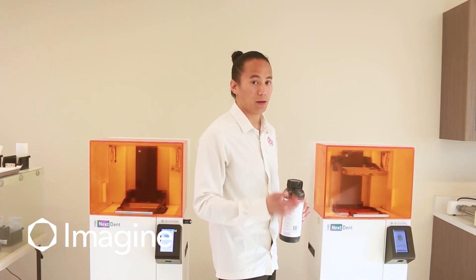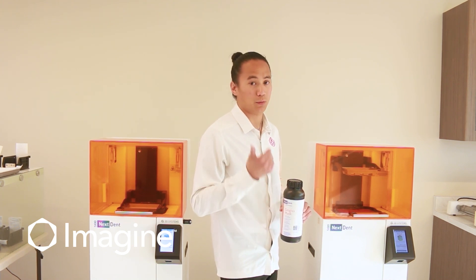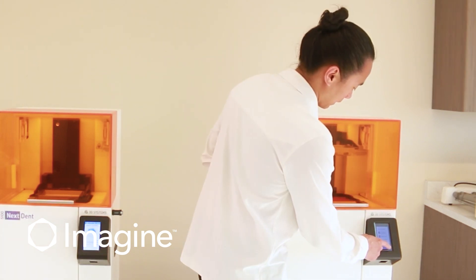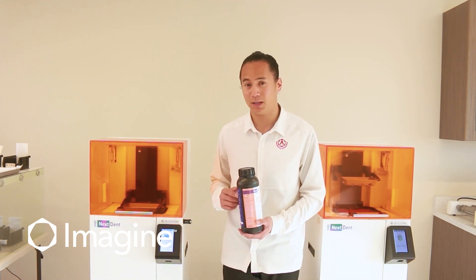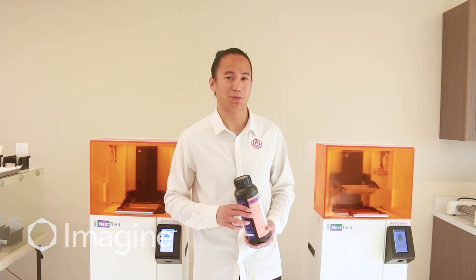We're going to go ahead and start this job. All of the checks have already been done — the print platform is clean, the resin tray has enough material, and the resin inside the resin tray has been properly stirred. All we have to do is wait for these to print. Your models are going to take about 45 minutes, the gingiva is going to take about 20, and after that we'll go into post-processing.